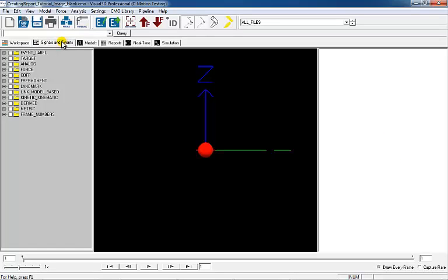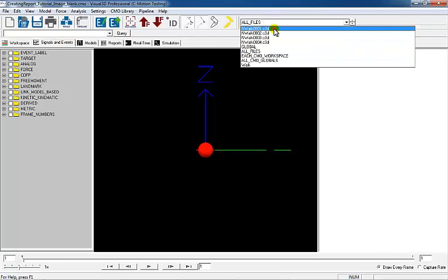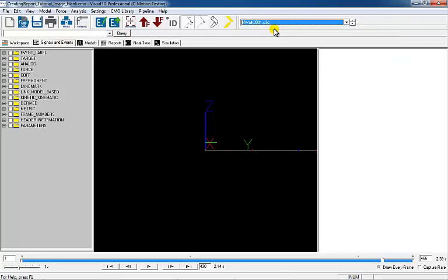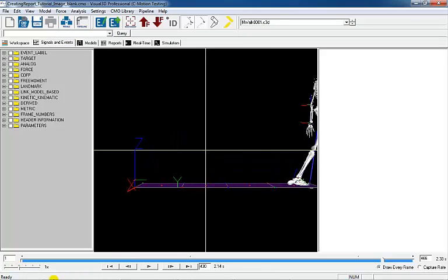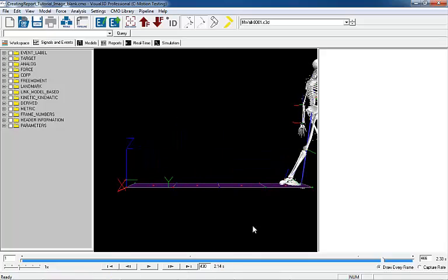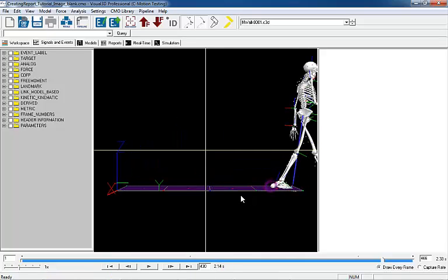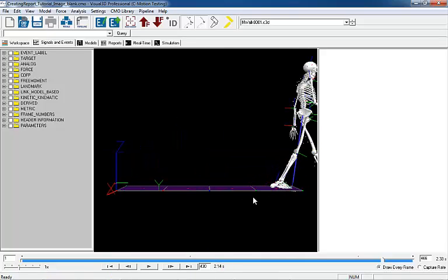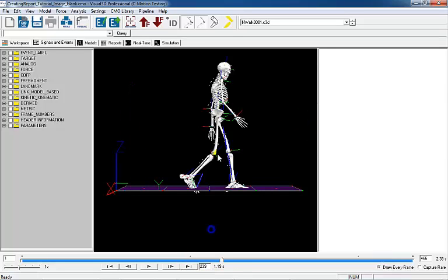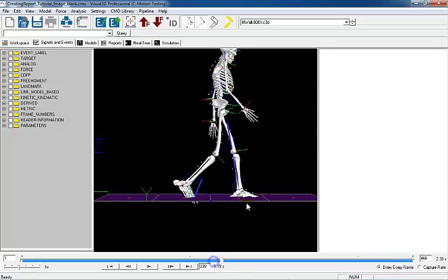Before exporting the image, go to the workspace tab and set the active file as the file that will be exported. Set the frame to be exported and set the camera perspective as desired by panning, zooming, and rotating the 3D viewer.